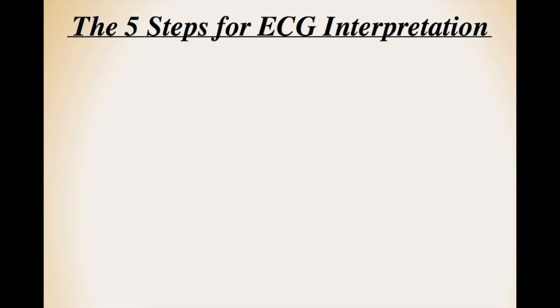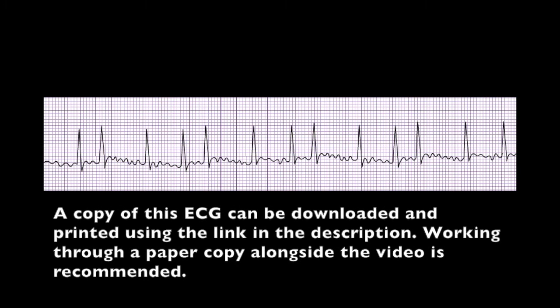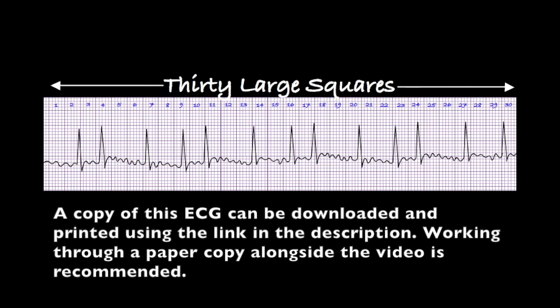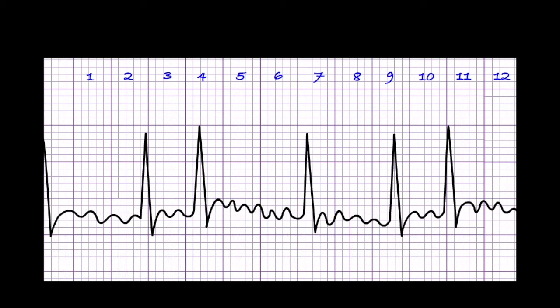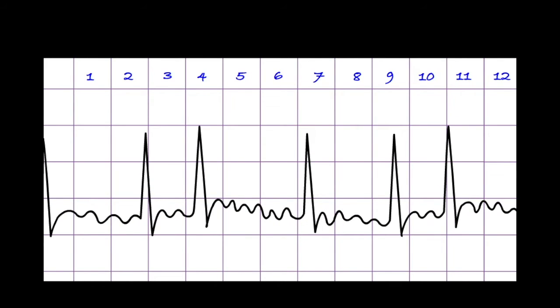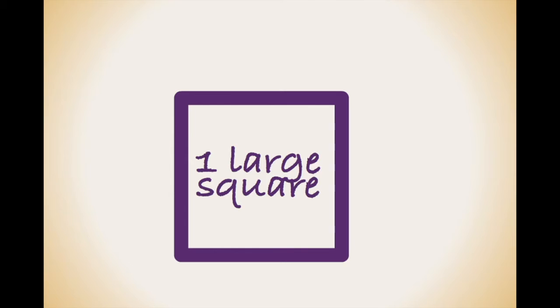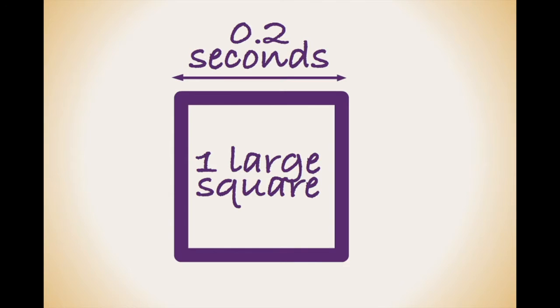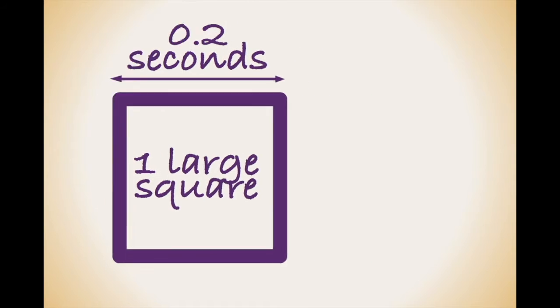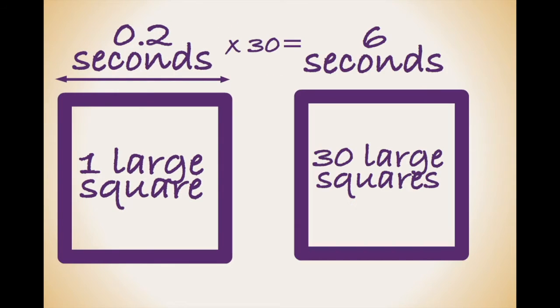The first thing I want to do is work out the rate. I'm going to start by counting out 30 large squares from left to right on my rhythm strip. I only want to look at the large squares at this stage, so I hide the small squares to keep things simple. Every large square represents 0.2 of a second, therefore 30 large squares represents a six second time period.